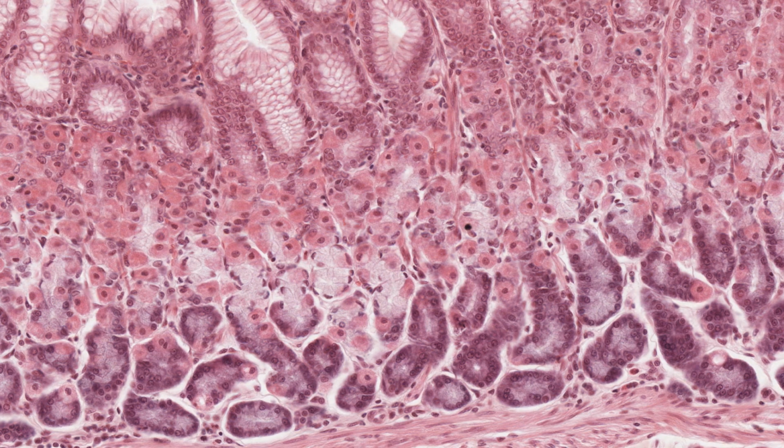For instance, on the very surface, you see these invaginations of an epithelium. And those invaginations have clear, staining mucus cells on the surface. The mucus stored in the cell cytoplasm was lost during the alcohol dehydration of the processing, and therefore there's nothing there to stain, so it appears very clear.